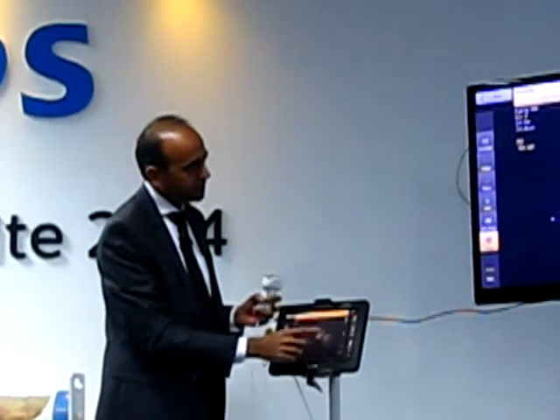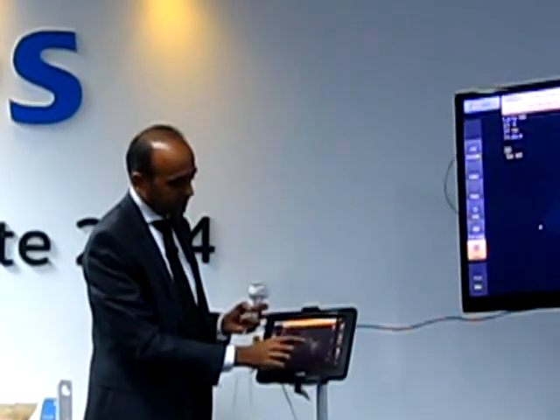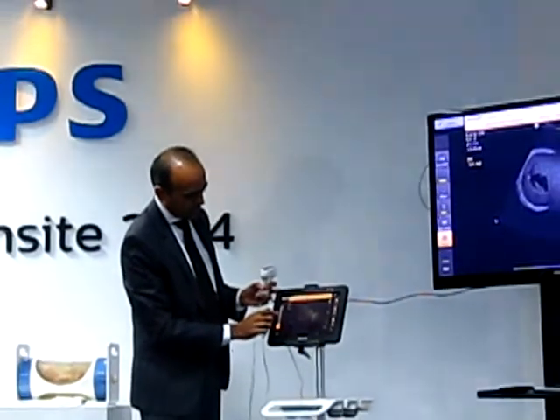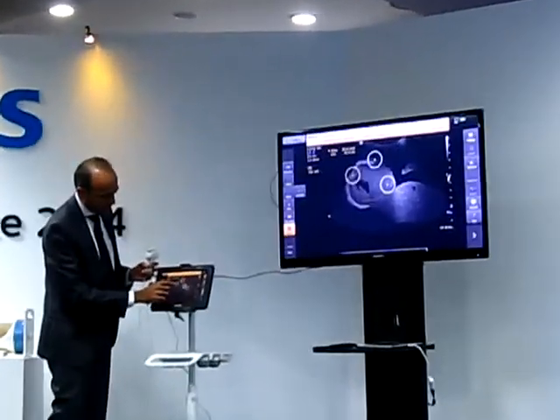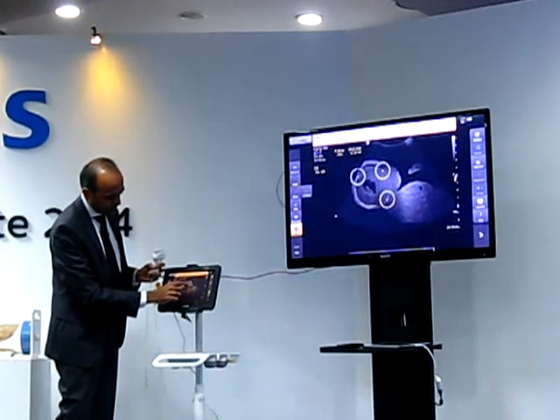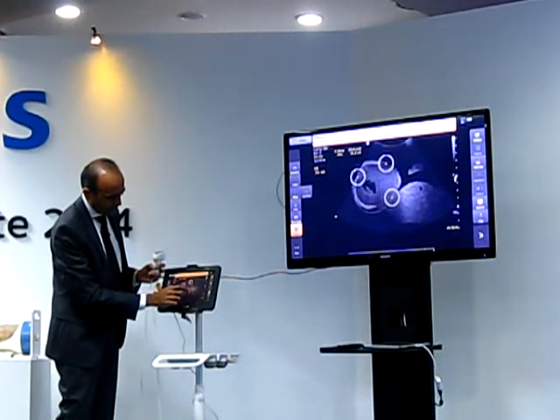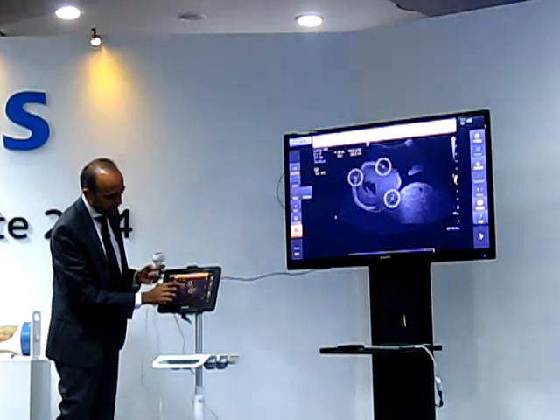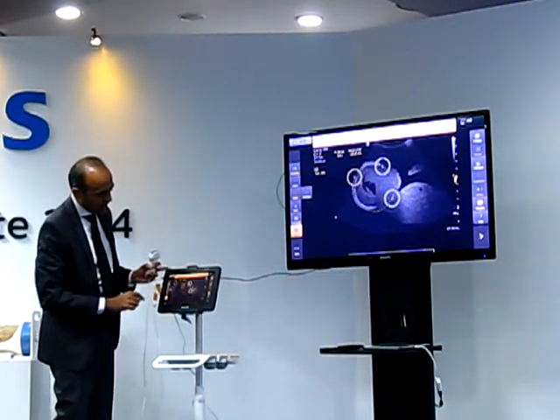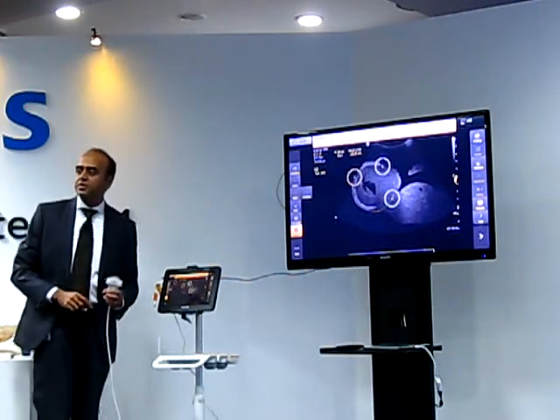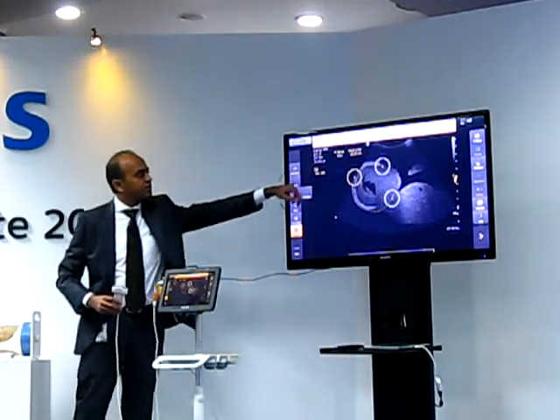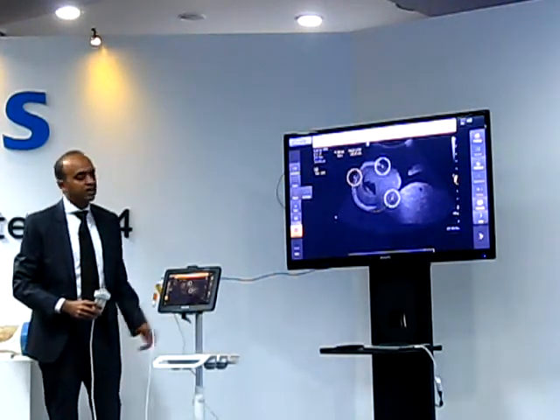One of the normal things a doctor does is measure the head circumference — is the head developing properly? It's so easy. You just press it, get a little menu, go to ellipse, bring it up. It tells me that the circumference is 20.9 centimeters — right here, there's the area and the circumference. That's it. It takes less than 10 seconds to do this.